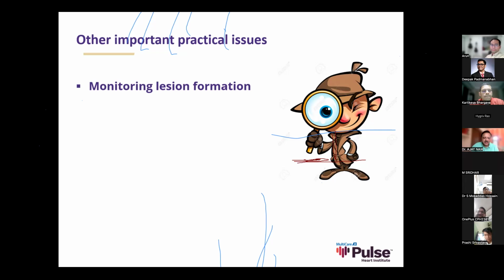Yeah, actually, I was making the same point. There is a small current always on the moment the catheter or system is connected. And Dr. Raja Selvaraj had talked about it during his first presentation also. When we were talking about local impedance, it is again the local impedance in the tissue where you are actually making the ablation lesion.